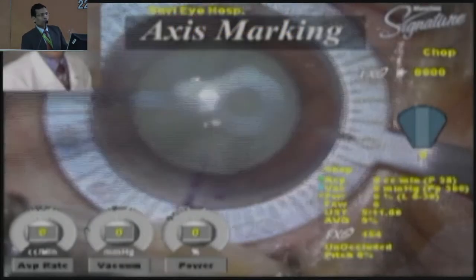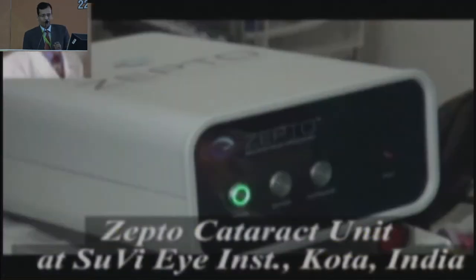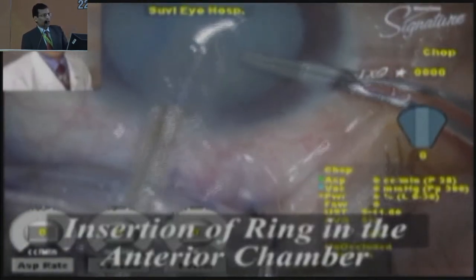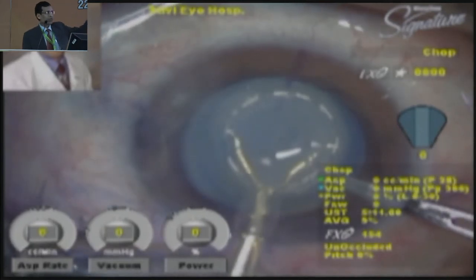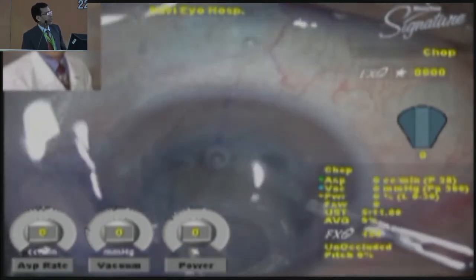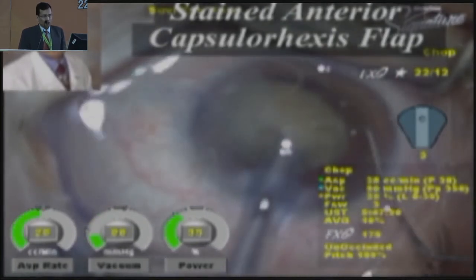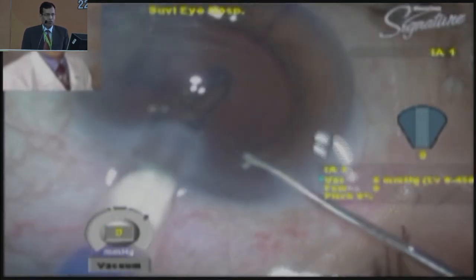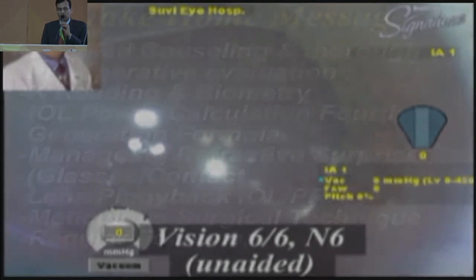Sometimes we come across cases of hypermature Morgagnian cataract. In such cases, the chances of achieving a successful capsulorrhexis are difficult. We can use the Zepto nano-pulse technology to minimize the risk of an Argentinian flag sign. Once you achieve the capsular opening in such a case, the job is 50% done. Here we are using Zepto nano-pulse technology to achieve the capsular opening at approximately 5.25 millimeters. Once the capsulorrhexis is done, you can perform a phaco-chop technique under cover of viscoelastic, followed by implantation of a toric multifocal lens in the capsular bag. It's very important to remove the viscoelastic from behind the lens in the capsular bag.